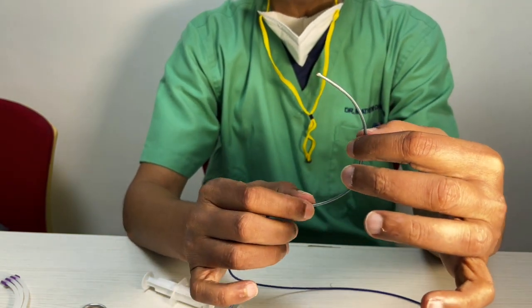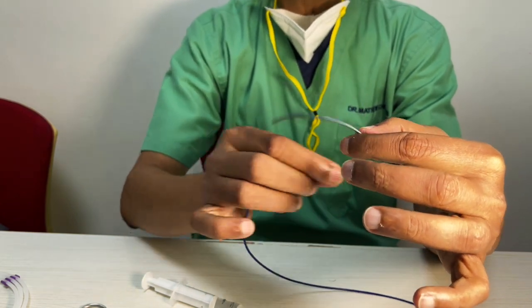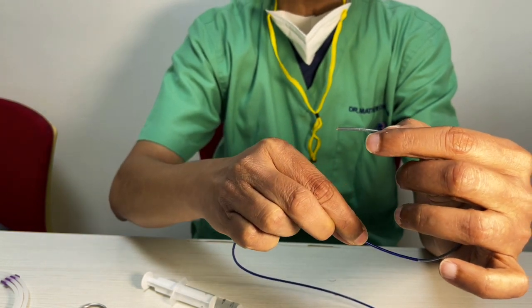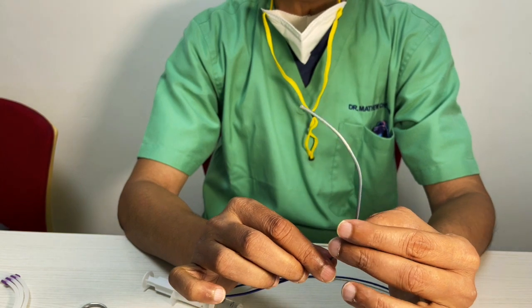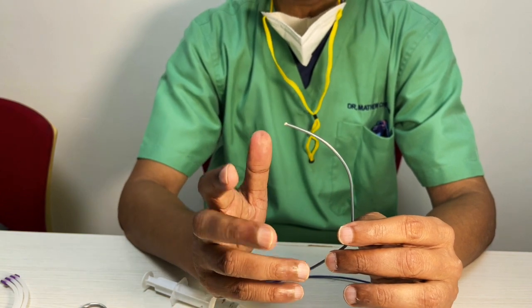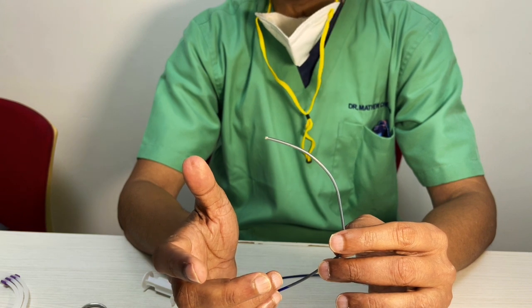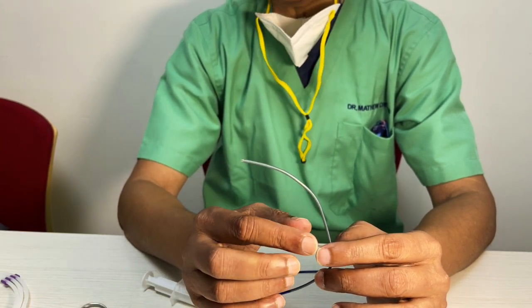So what's happening? You're doing a procedure, you're trying to push, push, push. Actually, instead of getting the push, it starts going down, and a point comes when it pulls the whole device down. To avoid that, you use a long sheath. When we started with long sheaths, we did not have a dedicated neuro long sheath. And we worked with the Cook sheath, which is called the Ansel sheath. I'll show you the limitations of an Ansel sheath and why the neuro sheaths came into practice.